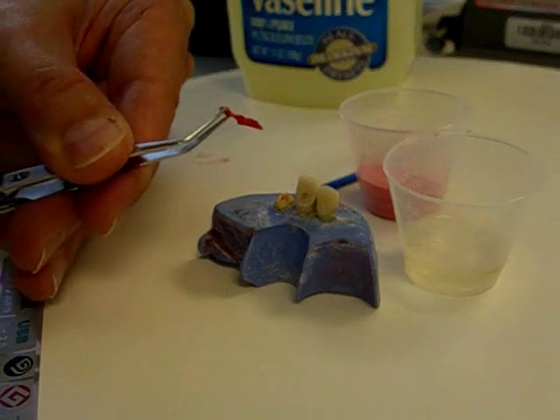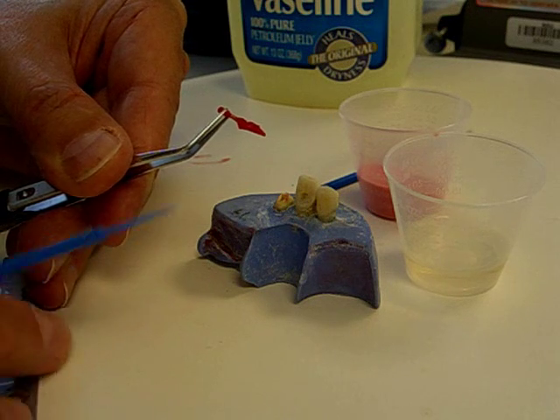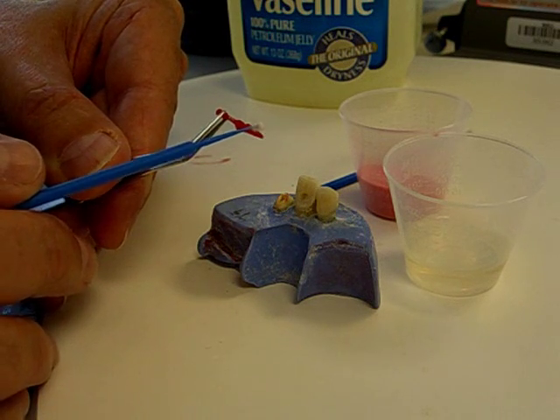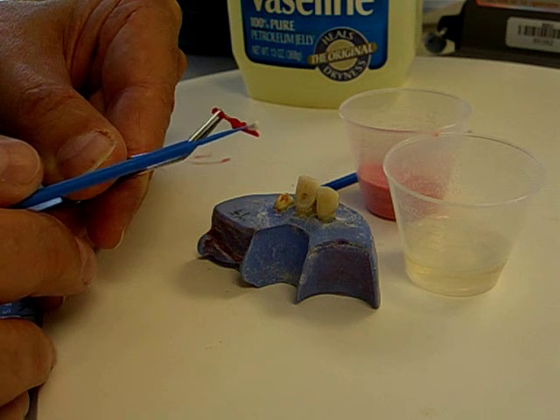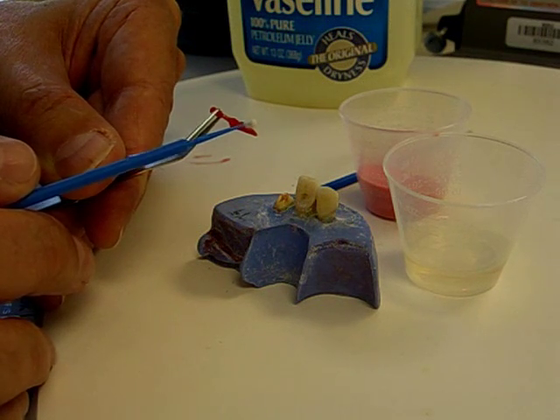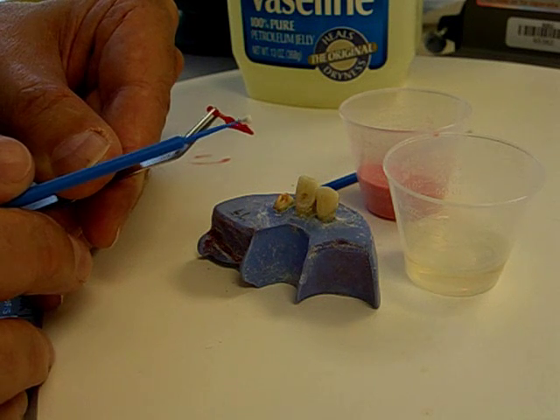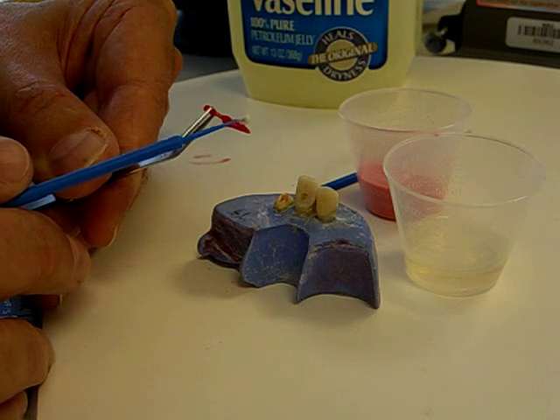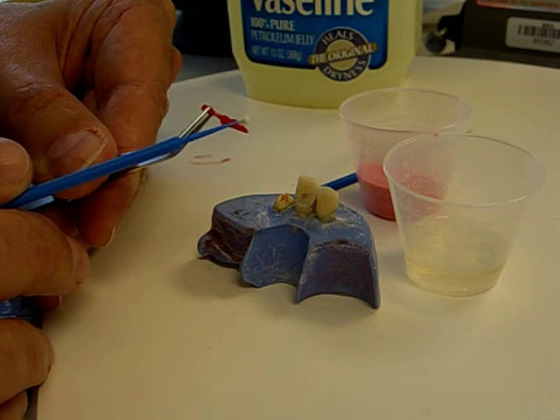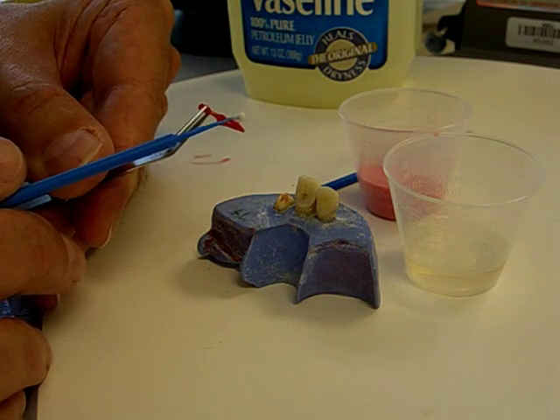One of the biggest errors that dentists make is in assuming that the very apical portion of the post has contacted the dentinal wall. That's the area that fits least accurately in general. So at this point, I'm going to add some monomer and polymer to this area so that I can capture any detail in the anatomical space at the very apical area of our post.